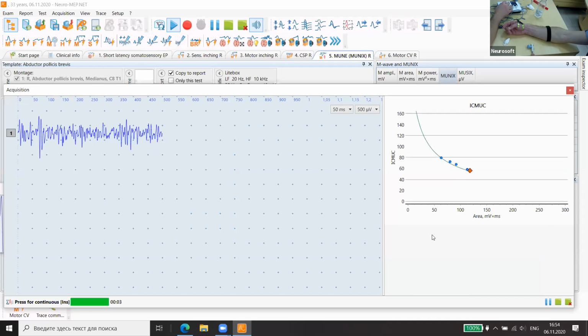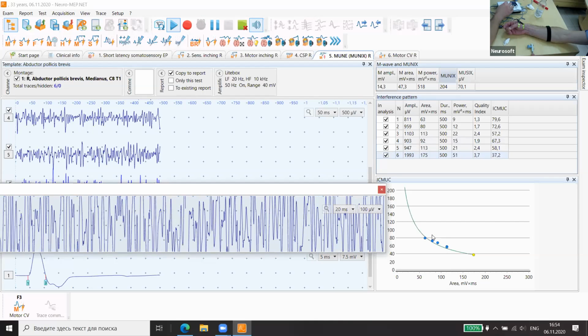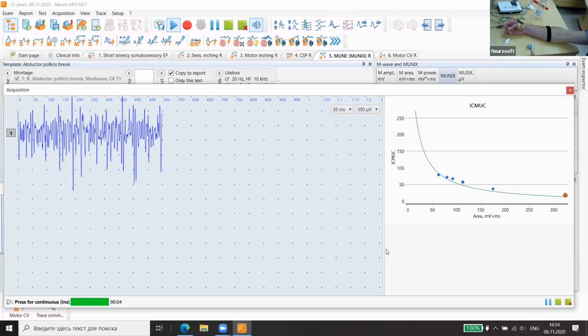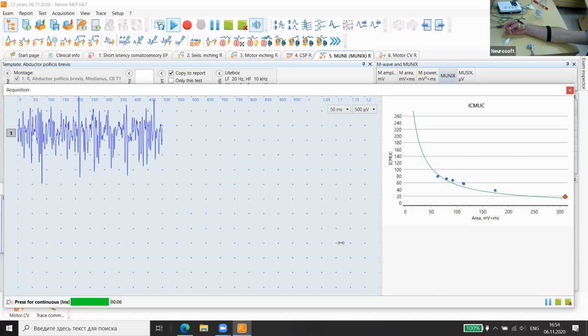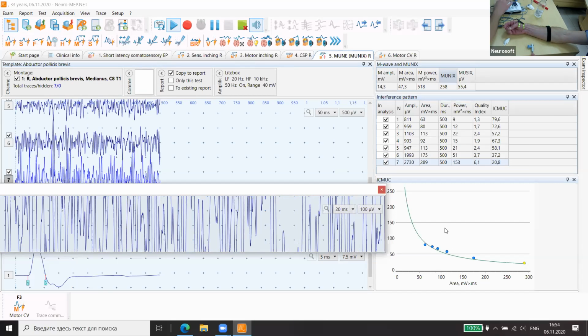So, increase tension, please. Yes. Some more. We can see our line.